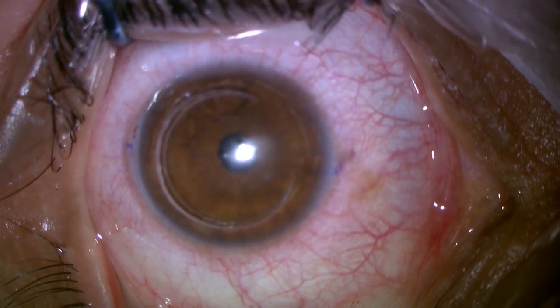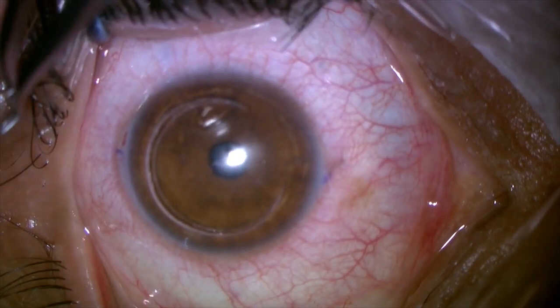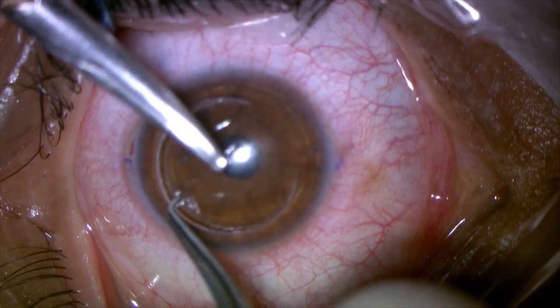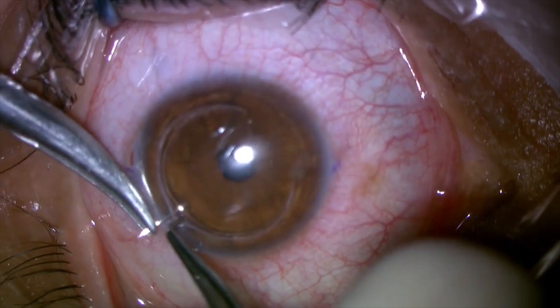So generally what Dr. Carriazo recommends is to start suturing the thicker or the widest gap in the cornea, and these are really stitches just like a penetrating keratoplasty or a lamellar keratoplasty. So you're going to start suturing at this edge and grasp the cornea. This is the steepest. And we go at 90% of depth. We come out exactly where we want to suture it.